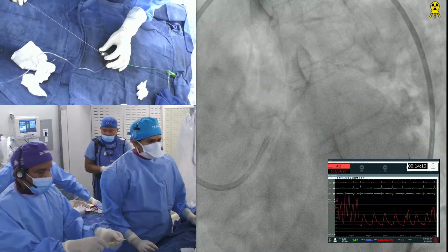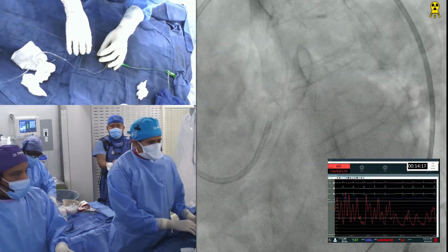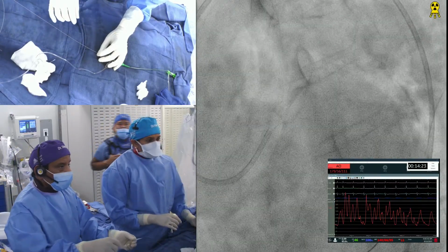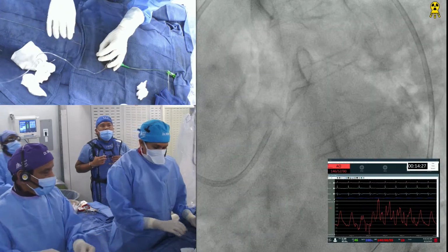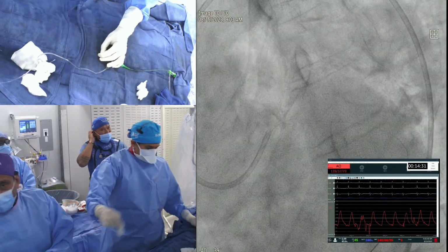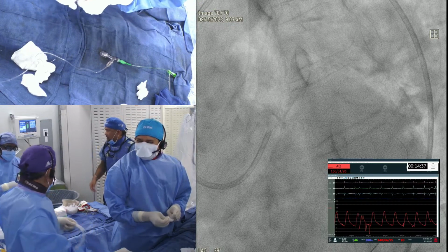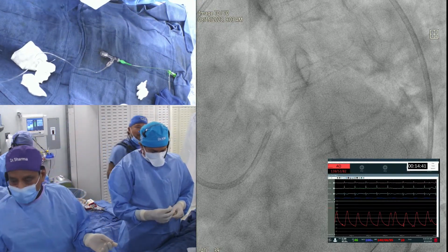Yeah, advance the wire, going out to the spleen. Liver now. Is Isha there today, or somebody seeing her cases? Or God is doing it. Because the guy is not there today. All right, let's see how things are.